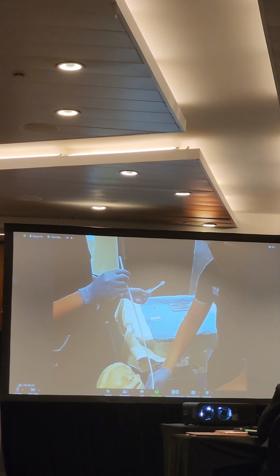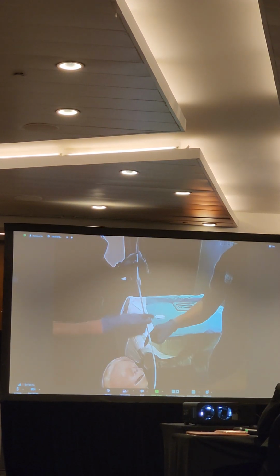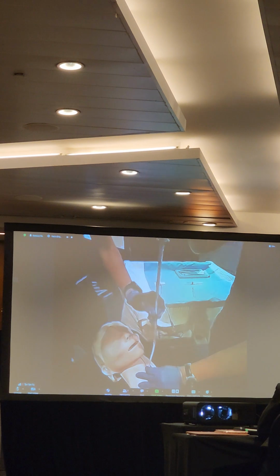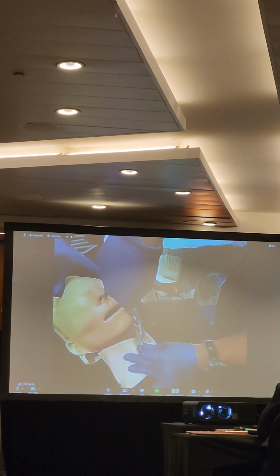Meanwhile, you secure the bougie close to the skin with your non-dominant hand. Your assistant will help you to railroad it very kindly, and then you hold on to the other end. Oh, this is uncuffed, yeah, good. And then we will railroad the ETT through.